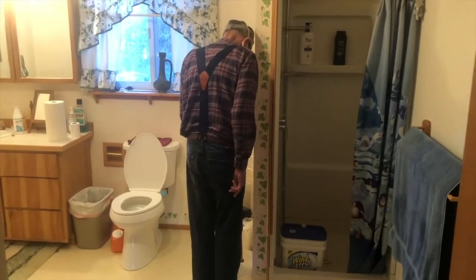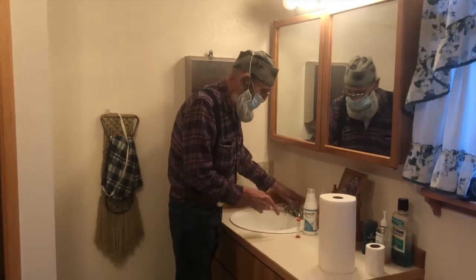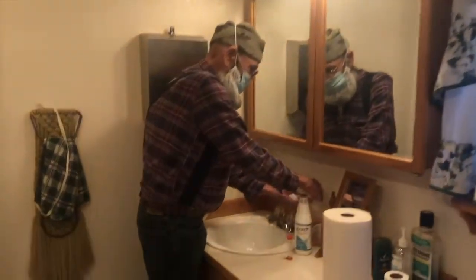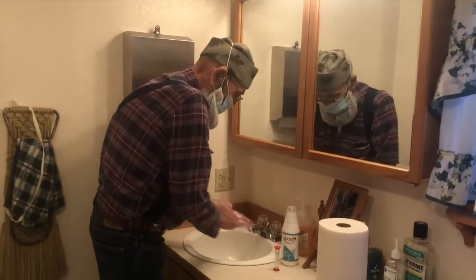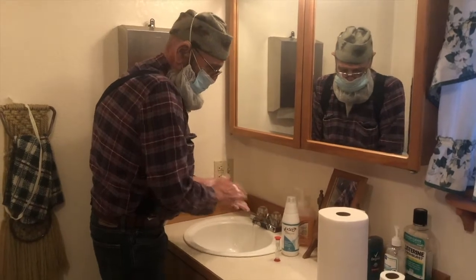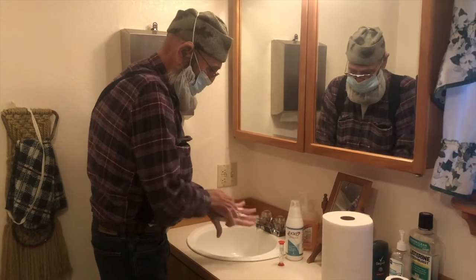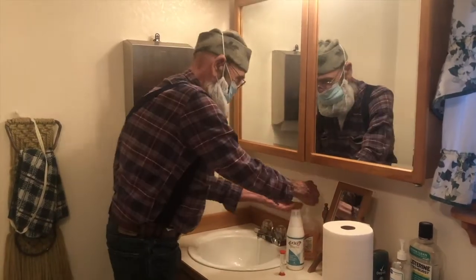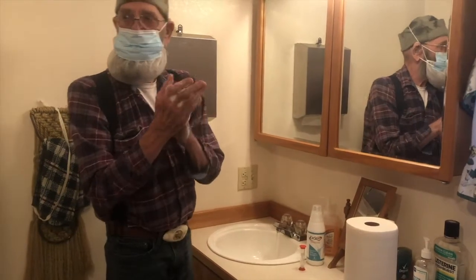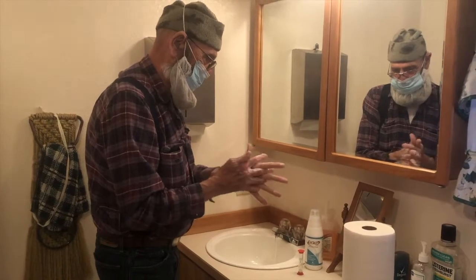First thing I do is weigh myself. 158.4. Then you turn this thing up, start your timer, and wash your hands really good and thorough. So 2 minutes. They furnish all my soap, all my sanitizers, even my little egg timer.